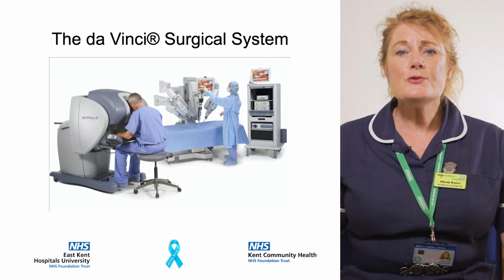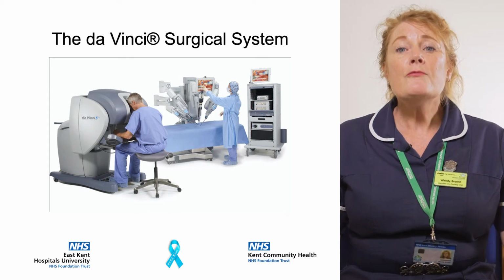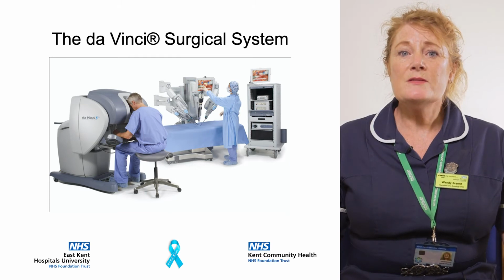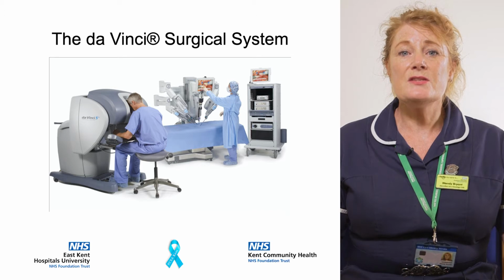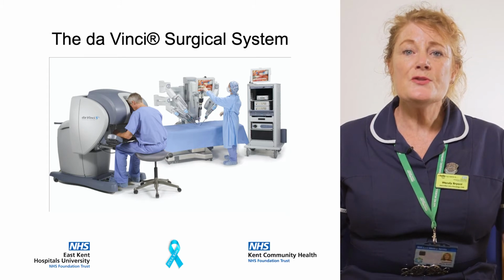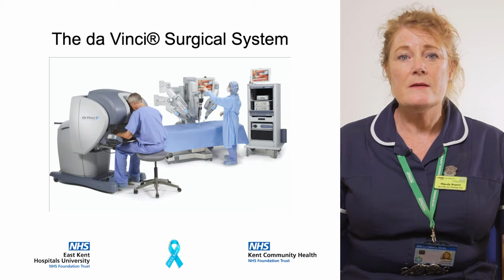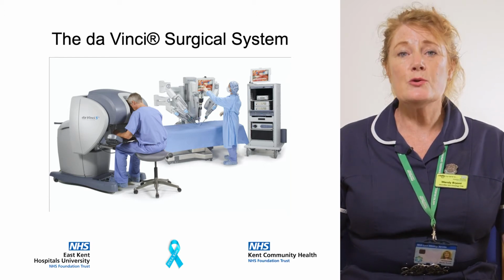The robot is controlled by the surgeon at all times and does not work independently. The robot is connected to the patient and very small instruments are inserted through small surgical incisions, keyhole incisions, in the abdominal wall. The surgeon sits at a separate console and carries out the operation without touching the patient. The surgeon has complete control of the robot at all times.